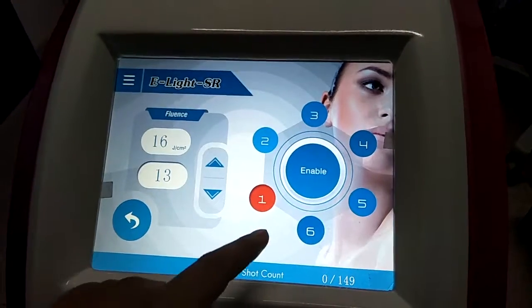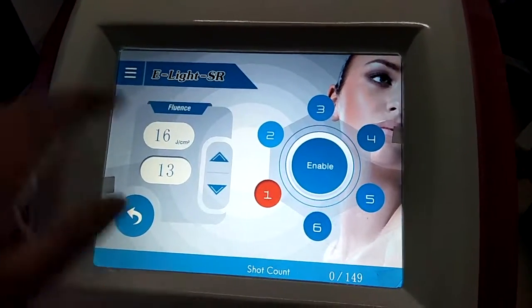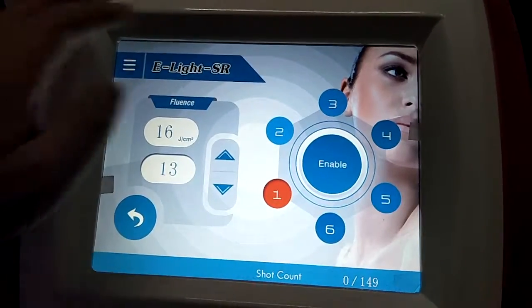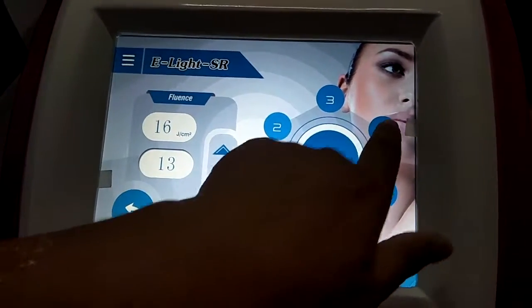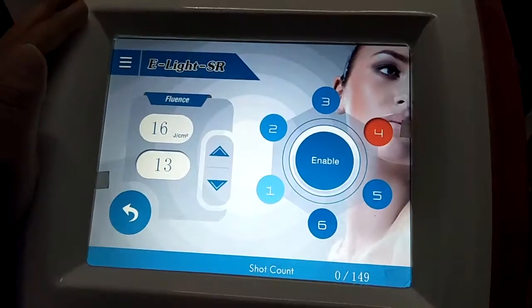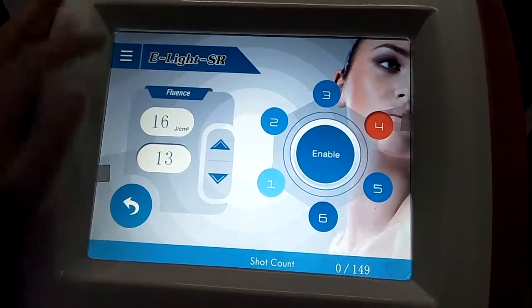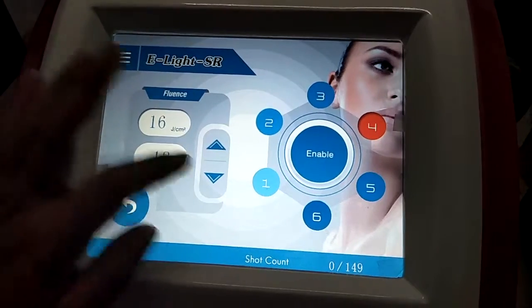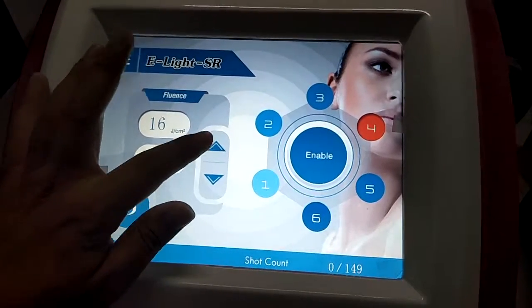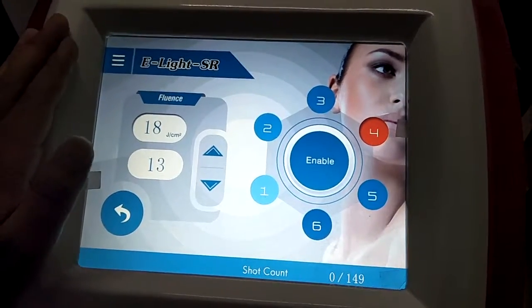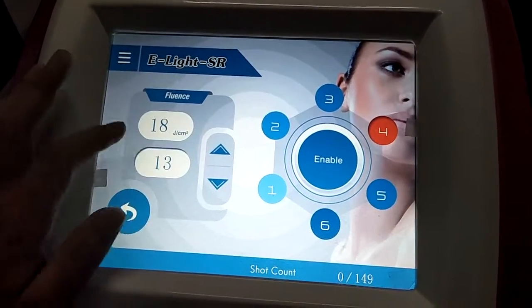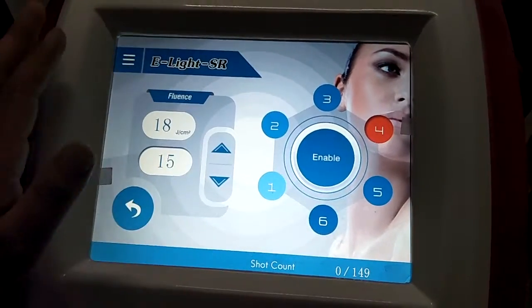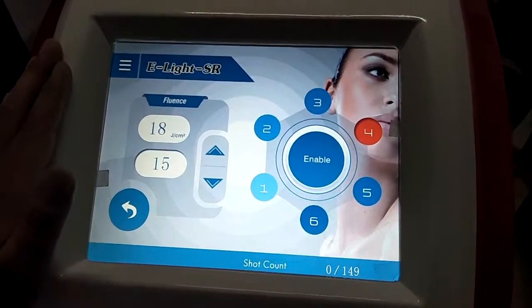Here is the skin type selection. For example, we can choose skin type 4 and adjust the IPL energy to 18. The RF energy — adjust to 15.